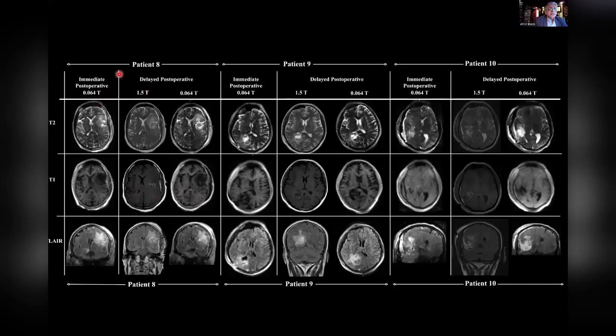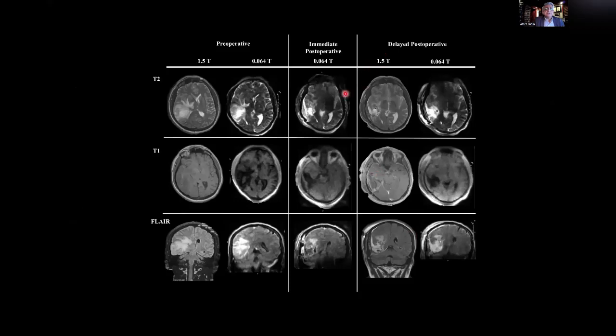So here, this is the immediate post-op MRI of 0.064 Tesla ultra low field, and this is the delayed post-op MRI. We don't have this one to compare with, but for the delayed post-op MRI, we have this comparison over here, and the immediate post-op MRI of another patient. Again, the delayed post-operative MRI. If you compare this 1.5 Tesla and this 0.064 Tesla, you do get an idea of what was resected, how much was resected. Here's another image, 1.5 Tesla, 0.064 Tesla. This is pre-op, so you get an idea of what I'm dealing with.